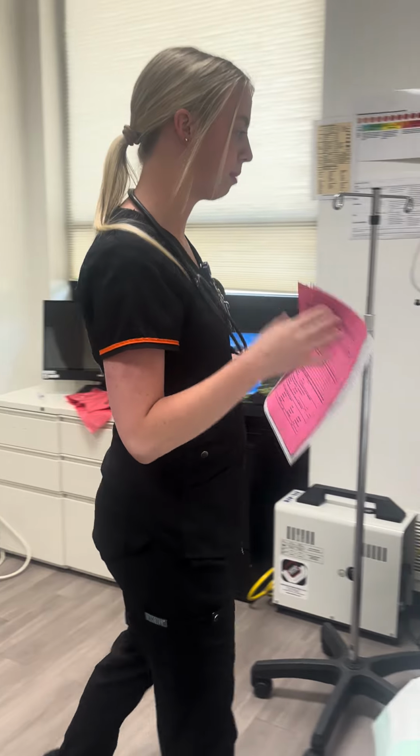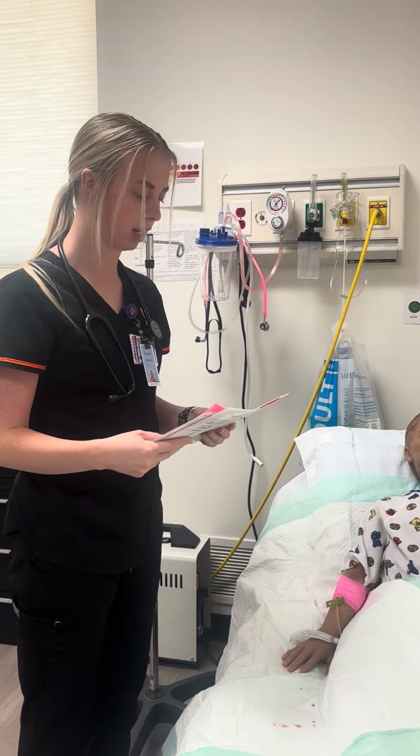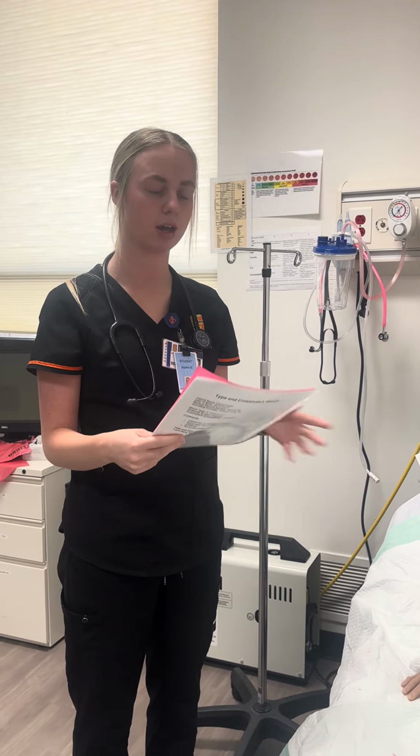Hi, my name is Sophie. I'm a student nurse. I'm going to do two patient identifiers, name and date of birth, have the patient give them to me as well. And I'm going to close the curtain, door, whatever, for privacy during the entirety of the thing, going in and out.